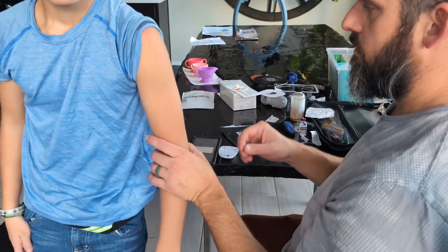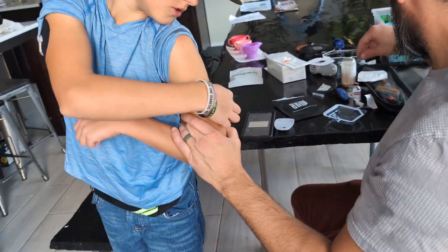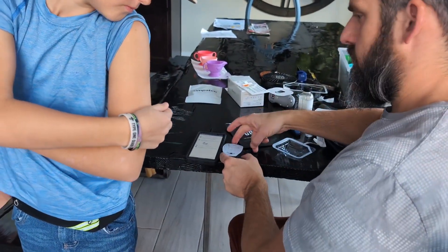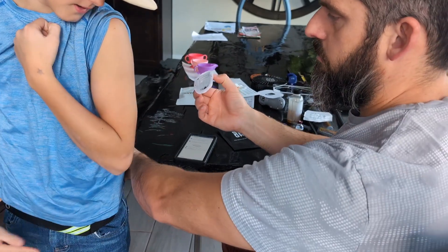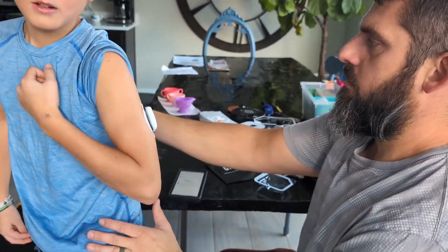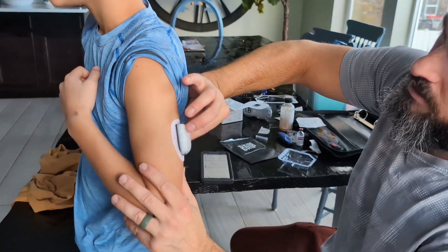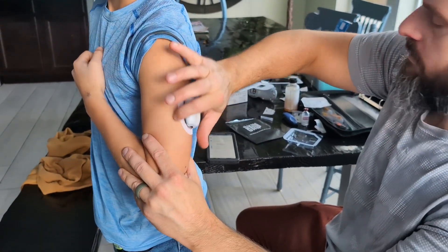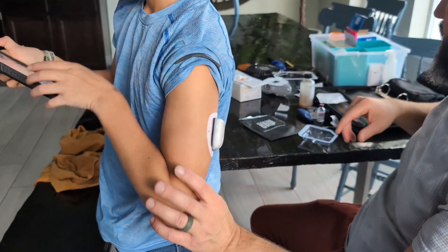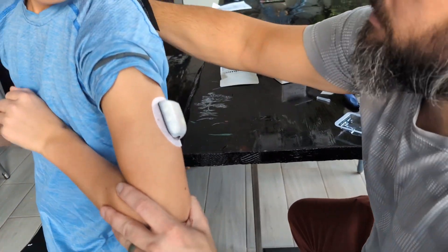Go ahead and turn. Where do you want it to poke you? Down there. And Riker, you put these on yourself sometimes, huh? Yeah. Okay, go ahead and start it. Now this is going to insert the cannula — a little tube that delivers the insulin.